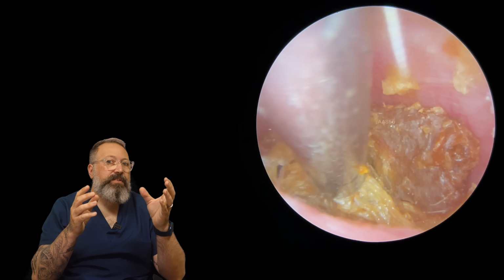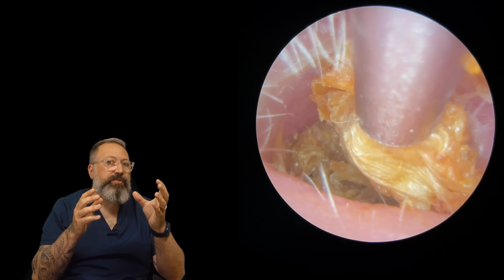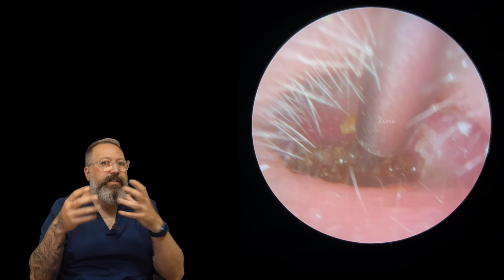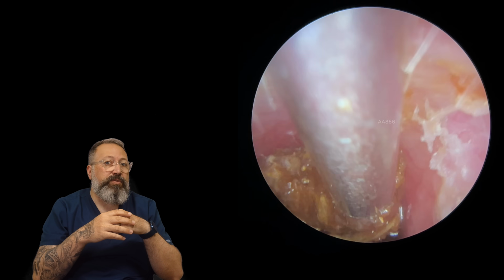Now I've managed to get obviously a big chunk of keratin out, so I'm going to see if I've got any more pieces that I can loosen up before we introduce a bit more olive oil. Normally I would keep going. If we're still getting little bits out and looser pieces out, I'd keep going until it looked like it wasn't going to budge anymore. Then I'd introduce a bit more olive oil, which is what I've done here.